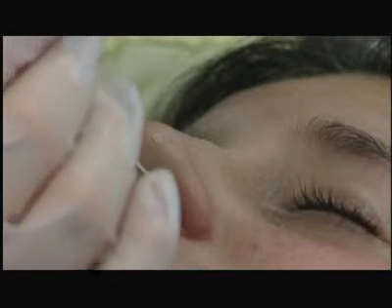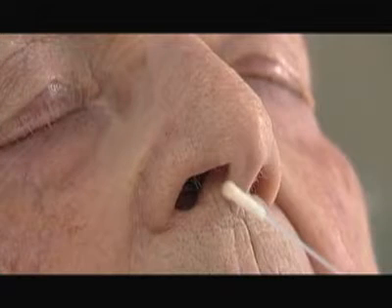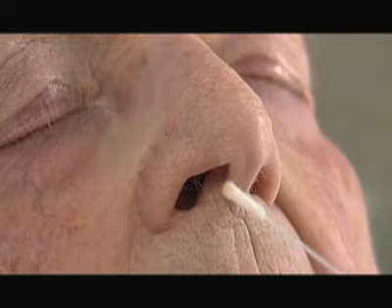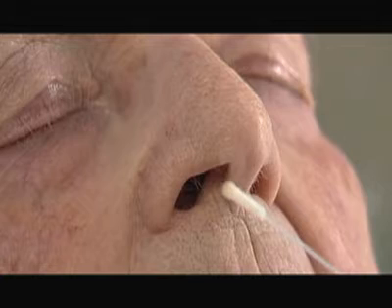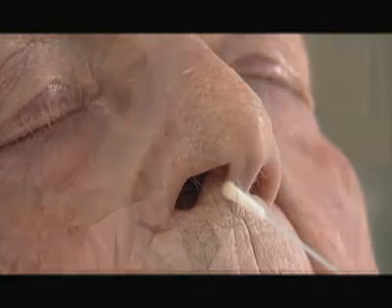However, the depth to which the swab can be inserted is specific to each patient, and determining this length is shown in each of the accompanying collection clips. Finally, these swabs should only be used for the collection of nasopharyngeal samples from adults and children, and should not be used to collect samples from any other sites.